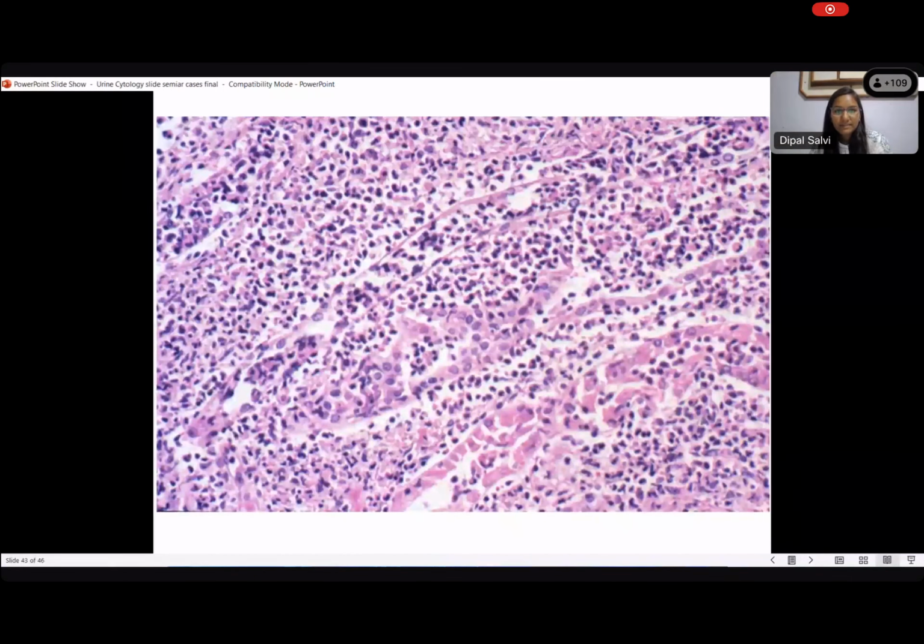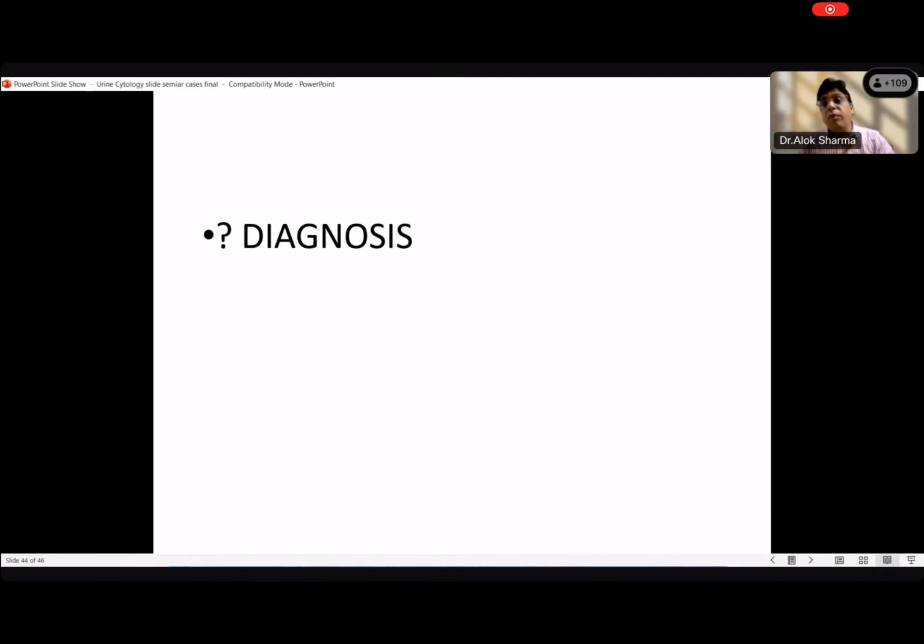Plenty of inflammatory cells. Yeah, fine. A lot of inflammatory cells, exactly what you were seeing. There are a lot of neutrophils. Neutrophil casts, neutrophils in the interstitium. They are all eating up the tubules. So it is damaged tubules with an intense infiltrate of neutrophils. So what is this? Acute interstitial nephritis? No, that is the acute difference. Acute pyelonephritis, yes, very good. So this is acute pyelonephritis.